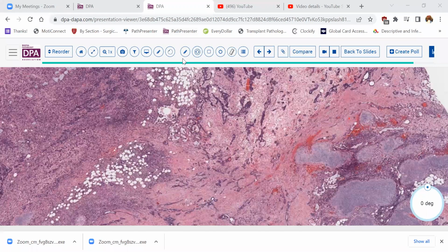Oh, very good question from Aruj. Differentiating mucinous borderline tumor from mucinous adenocarcinoma. So the features that I find most useful in that situation are the degree of atypia and the extent of atypia. So mucinous carcinoma arising from a borderline tumor, you look for two features.